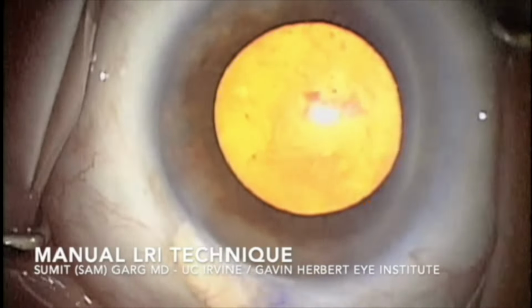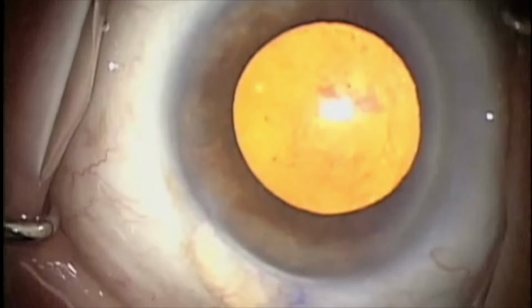This is Sam Garg from the Gavin Herbert Eye Institute at the University of California, Irvine, and in this video I'm going to demonstrate a manual LRI technique. The first step is to use your LRI marker to adjust the length of the desired LRI. Depending on how much astigmatism you're trying to treat, the length will vary. In this step I'm using my fingers to try to set the length and the axis for which I would like my marks to be on the cornea.